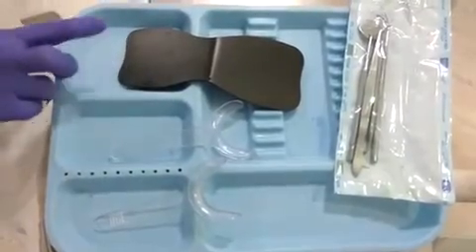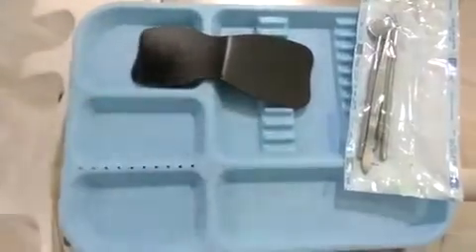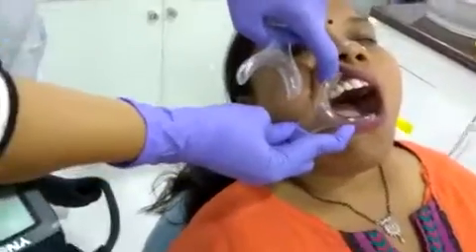Or you can take your assistant's help and ask her to hold the contrastor — I think it will be easy with that. So there we go, we just place one of the retractors here.